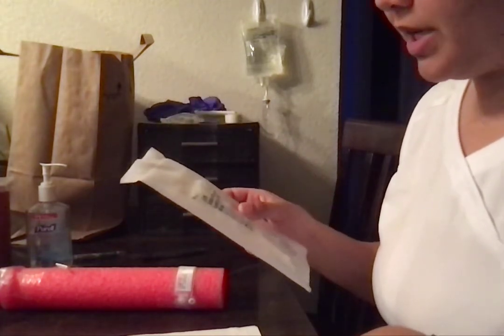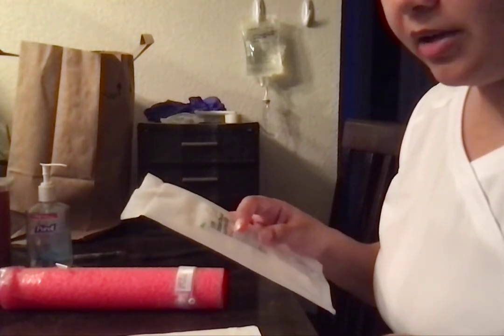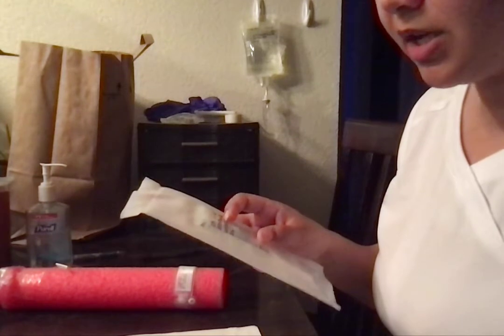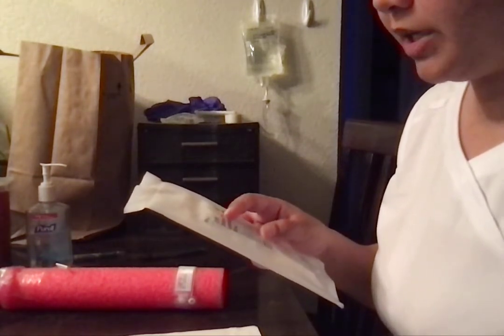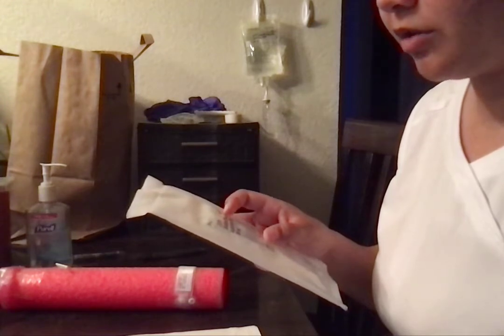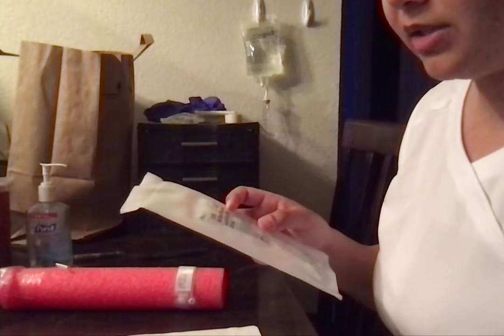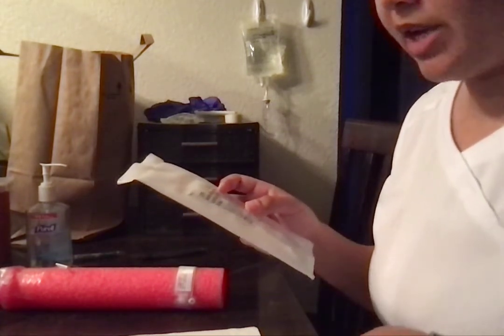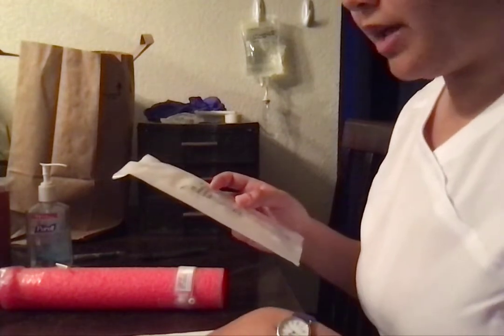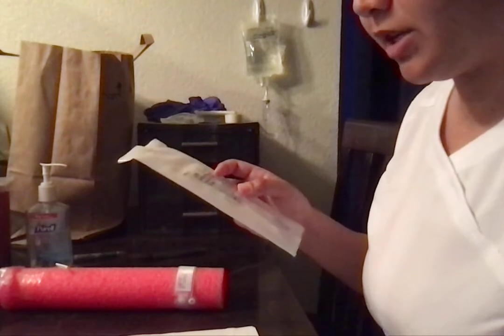So we have my 50 milliliter bag of ciprofloxacin, 200 milligrams in 0.9% sodium chloride IV piggyback. We're going to run it over 30 minutes. Do the math for that for your UTI. It is due now, and she has no known allergies. It is for patient Millie Larson, date of birth 1/1/1936. Okay, everything looks right there.